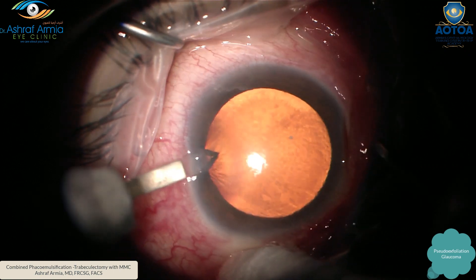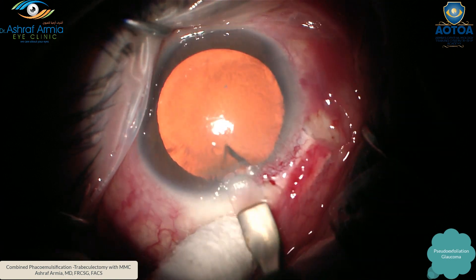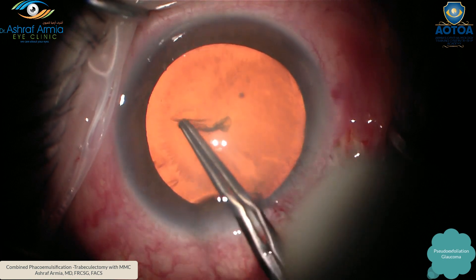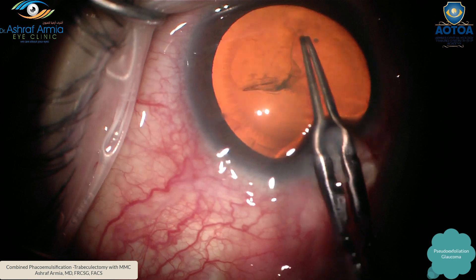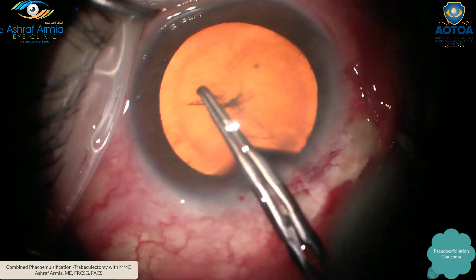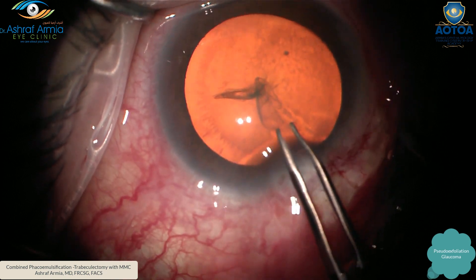Then I take a superotemporal position, make my two paracenteses, and inject my viscoelastic. In these cases I like to protect the cornea very well. A good size of the capsulorhexis is very important in a combined FACO trabeculectomy — not too small and not too large — to keep the IOL centralized and avoid post-operative inflammation or complications.